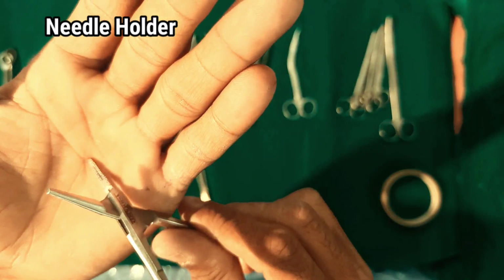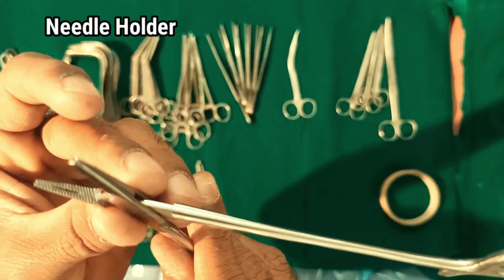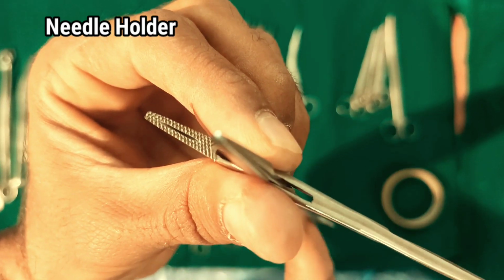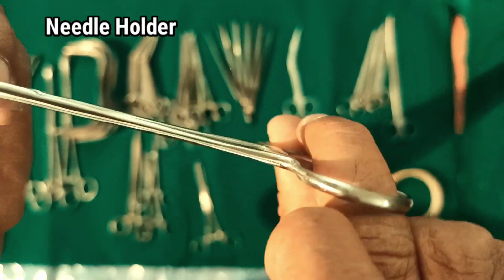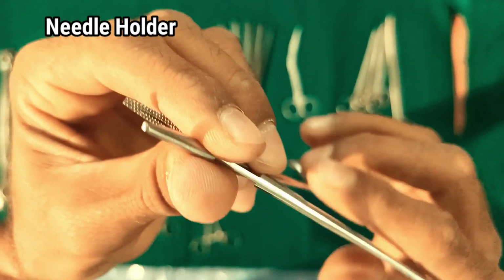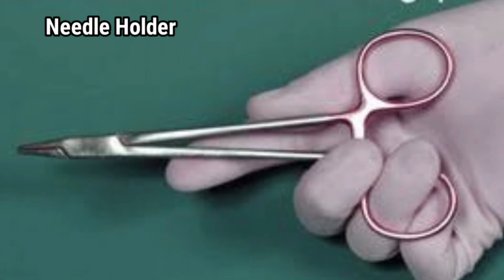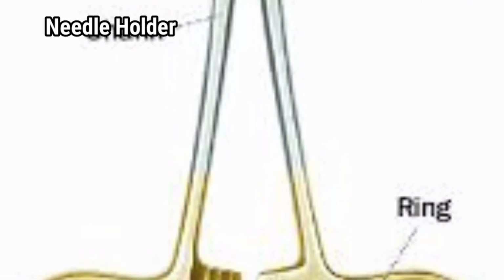Being specialized forceps, the components of a typical needle holder are the jaws, the hinge joint and the handles. Most needle holders also have a ratchet mechanism that locks the handles together and clamps the needle firmly between the jaws, allowing the user to maneuver the needle through various tissue without having to keep squeezing the grip. To maintain a firm grip on the needle, the jaws are often textured and short compared to the handles, increasing the mechanical advantage using the principle of a lever.